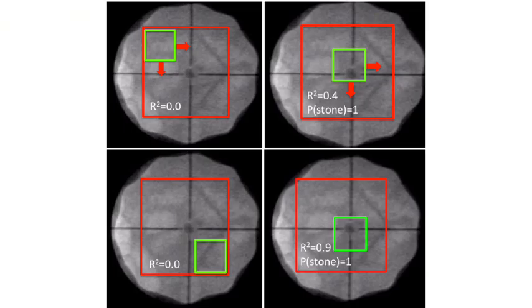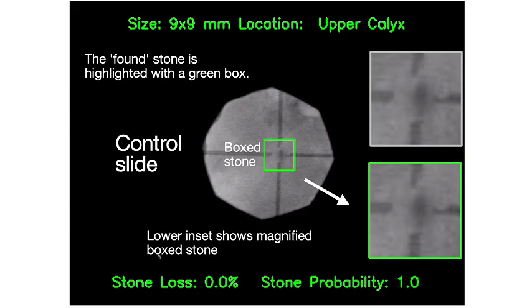Another great question. Yes, it is computationally intense, but the developers use a GPU-like function and only the images to perform the analysis. This speeds up the process to mere microseconds. Here is an example of the final product using an actual shockwave treatment.